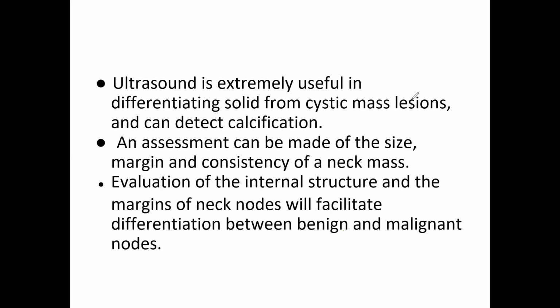The most important thing is solid tumor or cystic tumor. Is it a thyroid solid mass or a cystic mass, you could remember that. And it can detect the calcification also. Very important, any calcium. So imagine that calcifications can be detected. It's not the bone completely, but the calcification can be detected very properly.